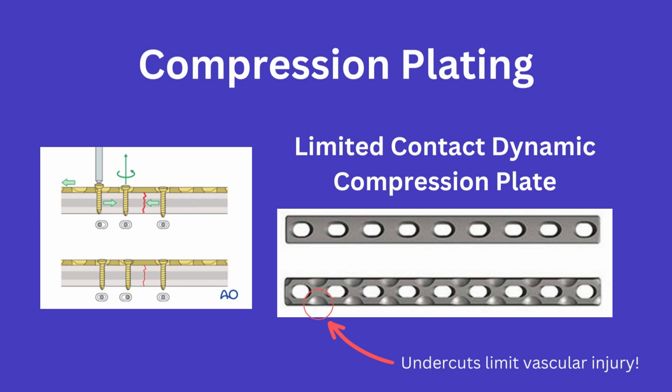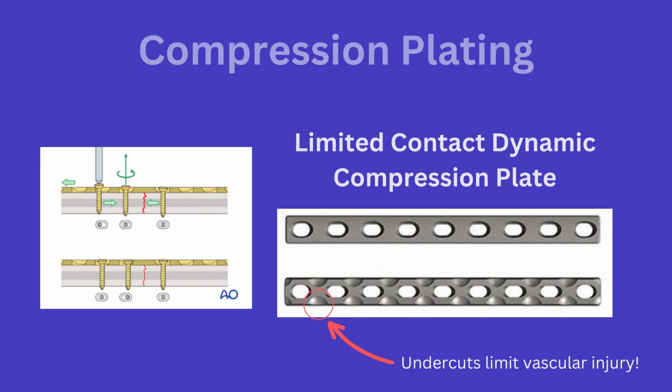Note the dynamic aspect of the plate is due to the oblong holes, giving one the ability to drill the screws away from the fracture in order to compress the fracture. The undercuts on the plate reduce the vascular trauma.